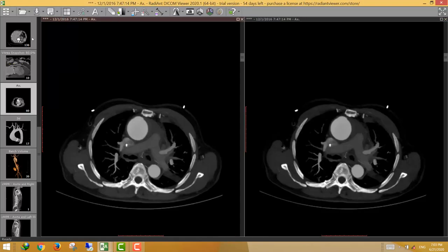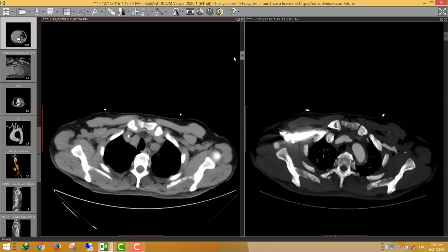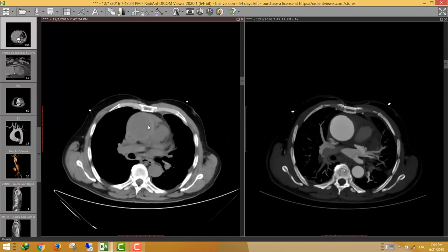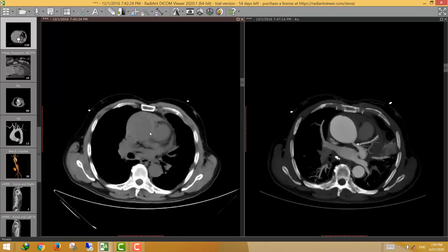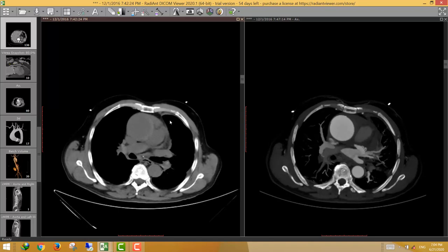This reveals the importance of pre-contrast imaging before CT angiography of the aorta, to exclude intramural hematoma. On the non-contrast study, the concentric mural thickening is relatively hyperdense. This hyperdensity is diagnostic for intramural hematoma.